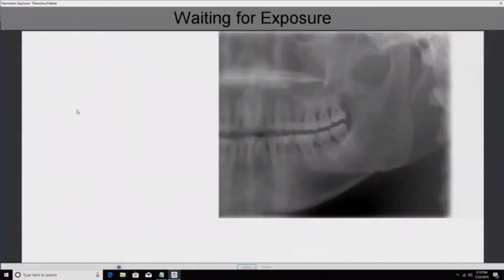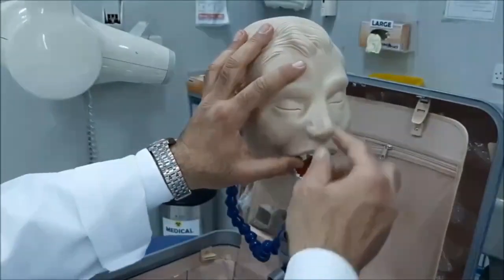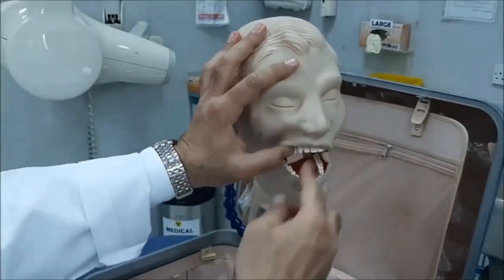These types of X-rays may be used if your dentist suspects damage to the tip of the tooth root or issues with the jawbone. The third technique is occlusal X-ray. Occlusal X-rays are designed to capture what goes on inside the roof or floor of the mouth, which helps the dentist see full tooth development and placement.